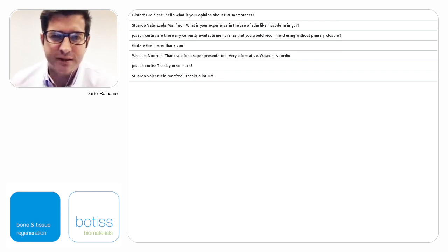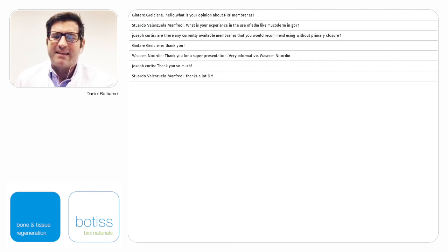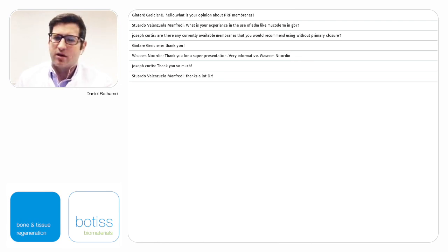So Joseph Curtis is asking, are there any currently available membranes that you would recommend using without primary closure? That's a bit complicated. If you check the indications for all the membranes that are currently available for GBR procedure, you see that they all have to be used in a closed condition, because there's only data available for that.